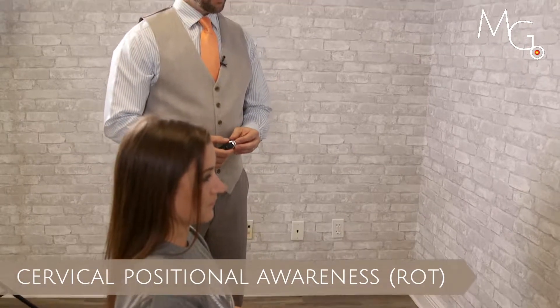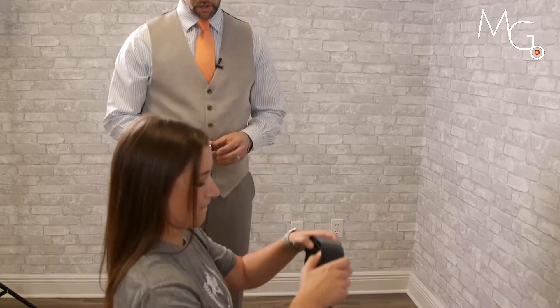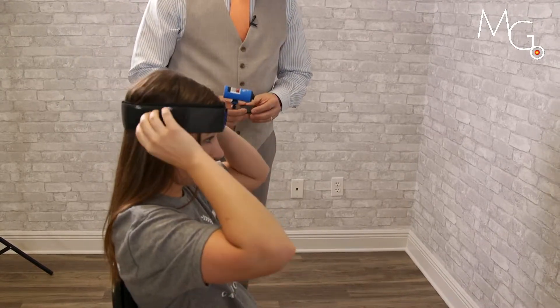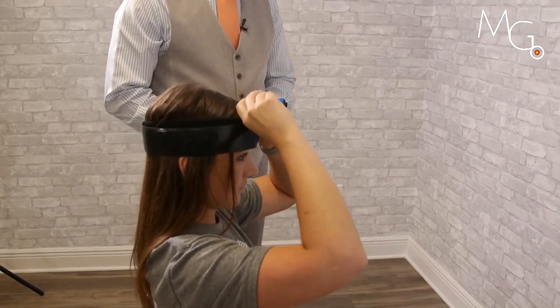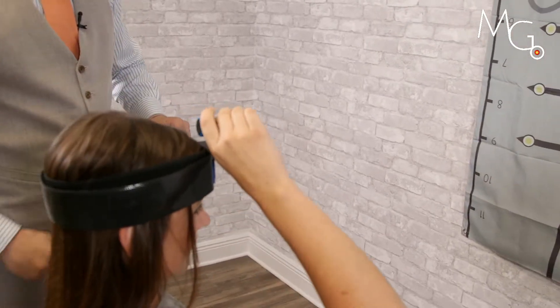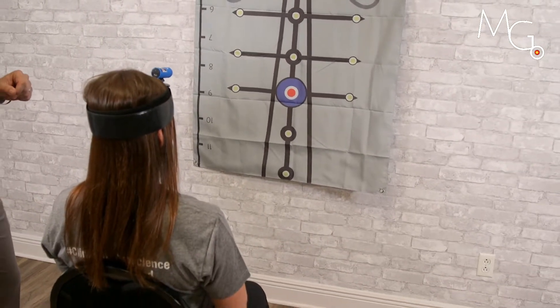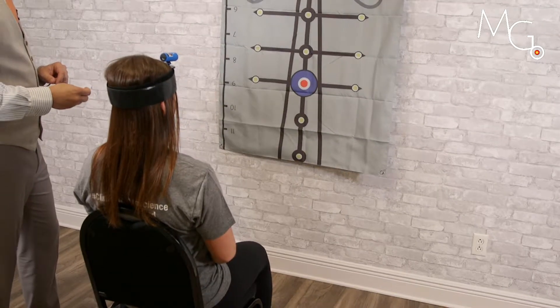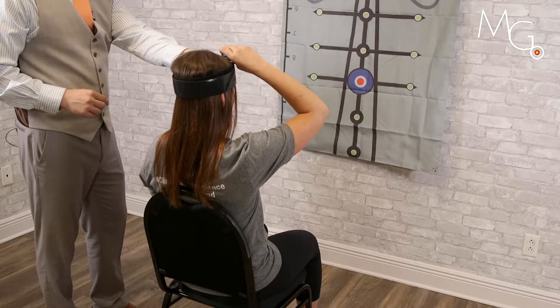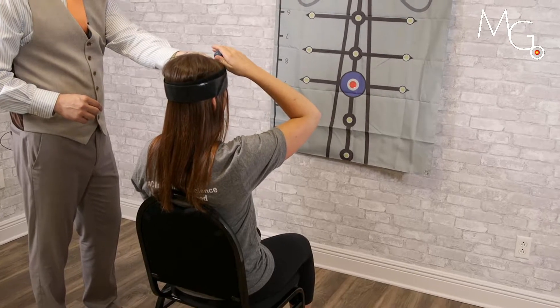For assessment and potential treatment of joint position sense error at the head-neck region, we can have the patient put the large motion guidance belt on the head with the perpendicular mount and the laser mounted on top. The patient will be positioned five feet from the center of the target from the crown of their head and sitting. We can turn on the laser and have them hold on to the cradle and position the laser down at the center of the target.